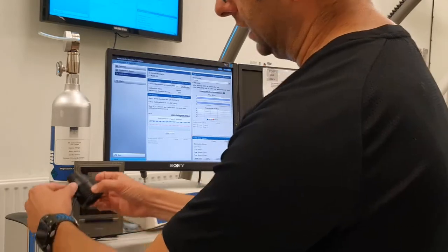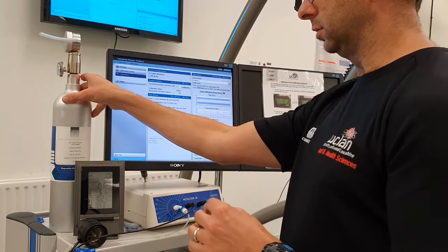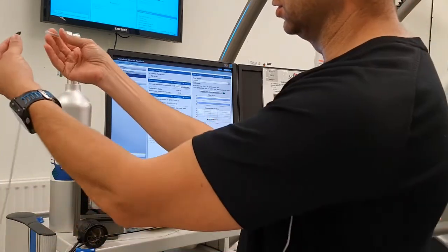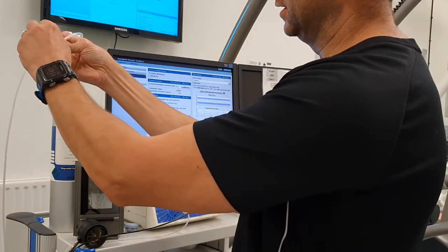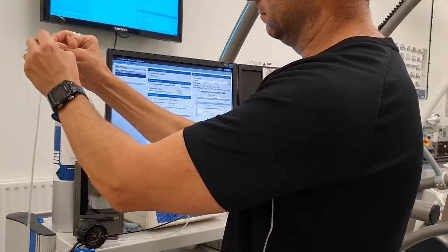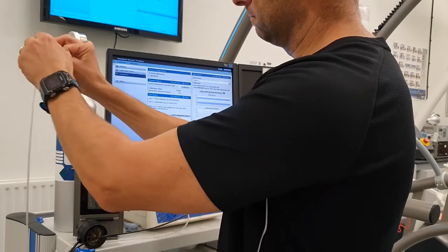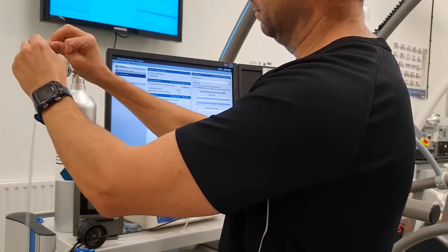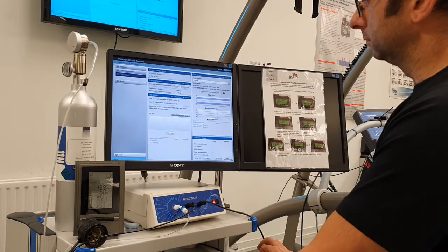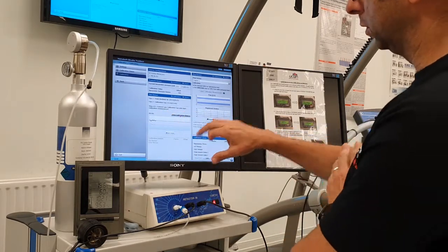Next we need to take the feed line out of the pneumotach and connect it to this bottle. This bottle contains a special gas formula which is 5% carbon dioxide and 15% oxygen. Carefully put that into the end of the tube — there's a bit of a tight fit. Then click Start Calibration Step Two. Again, we're just looking for a nice stable trace.